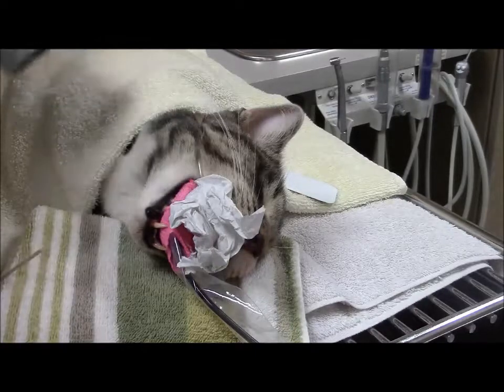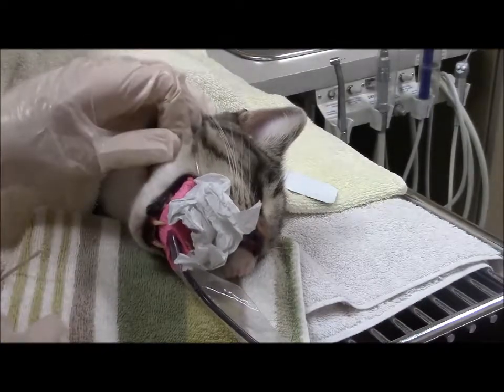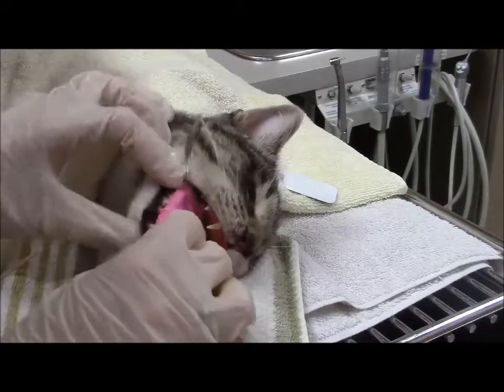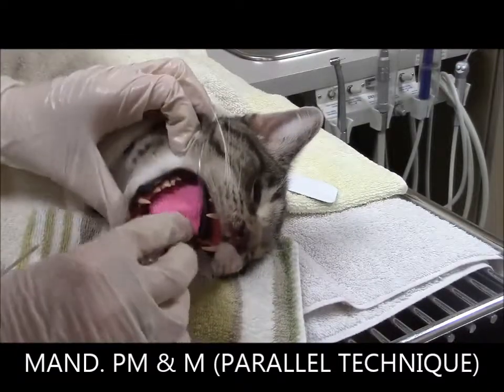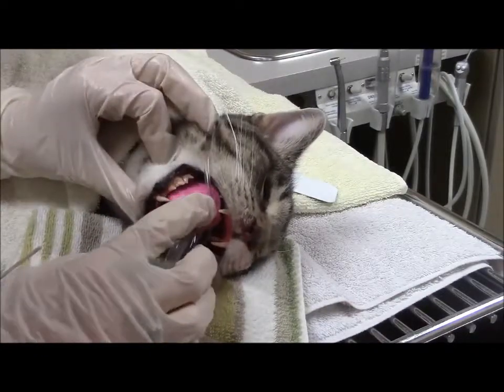When I take the x-ray and look at the screen, if I wasn't able to get that sensor pushed in far enough, what's going to happen is I'm going to be cutting off the last molar. If that's the case, then what you're going to do with your sensor, take it out and then just push it in like this as far as you can to do a parallel technique. So a parallel technique always works well in the last molar.